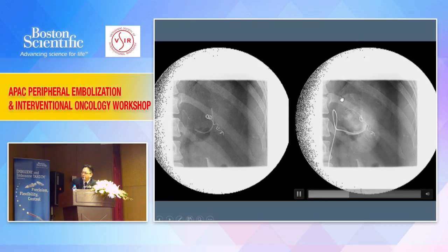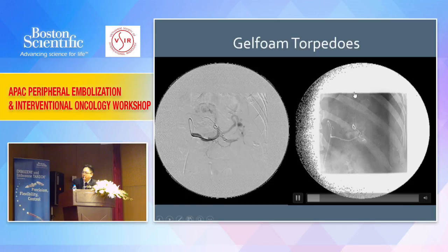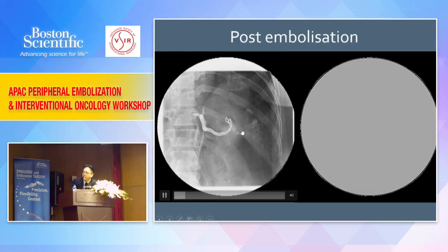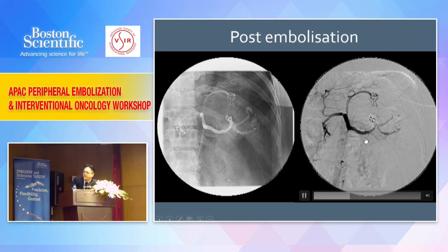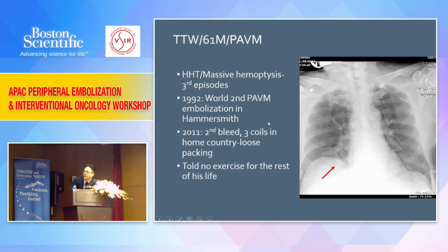Essentially, if I block the outflow, I stabilize the aneurysm with gelfoam, then I block the inflow with additional coil. You see, this already slowed down with the gelfoam torpedo. With additional detachable coil in front, then you achieve control. So again, detachable coil is critical in this situation.